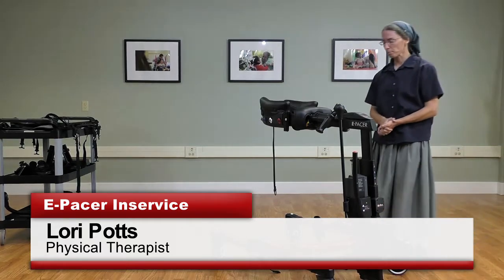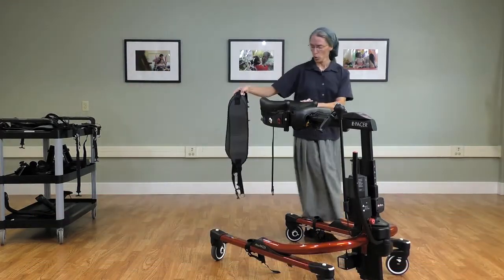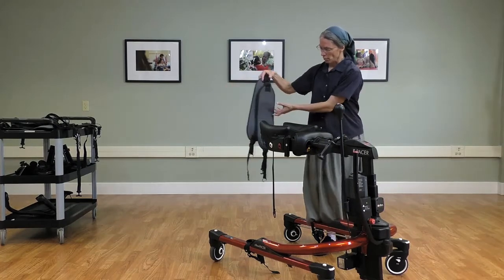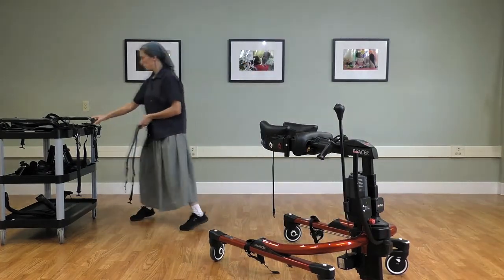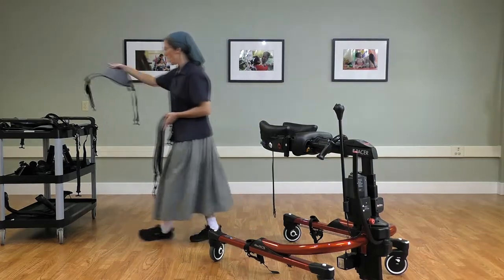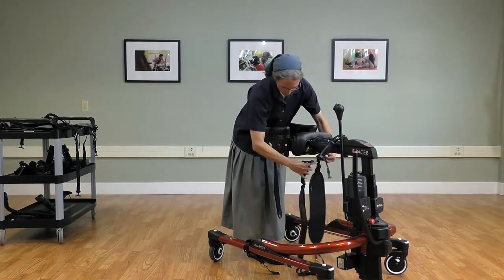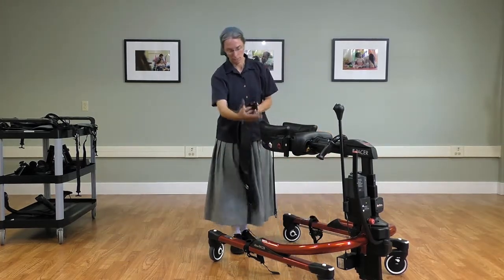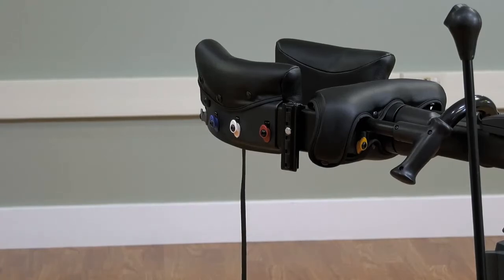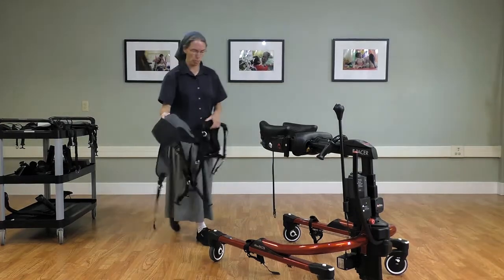In terms of using the body support system, you will use the same thigh straps as you are familiar with from the tram — there's the standard size and then the wider size. These attach with the tram on the yellow clips at the front, and then slide under the client's legs and attach here for that initial seated transfer.